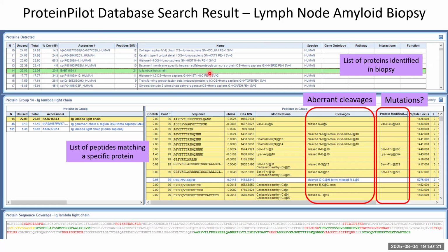However, the caveat is a lot of mutations can in actual fact be artifactual modifications like methylation, formylation, methylol. So we have to be cautious about interpreting this evidence proposed here and have a bit of a grain of salt when we look at those proposed mutations. But it is a useful source of information for us, as we'll see in a slide to come.